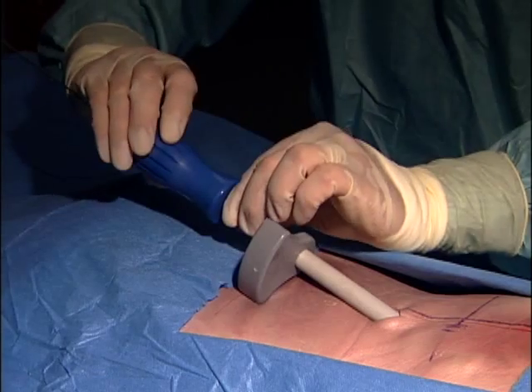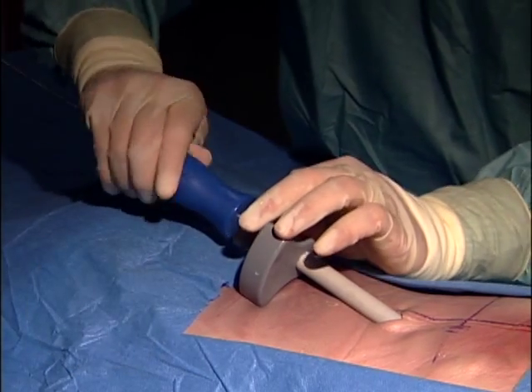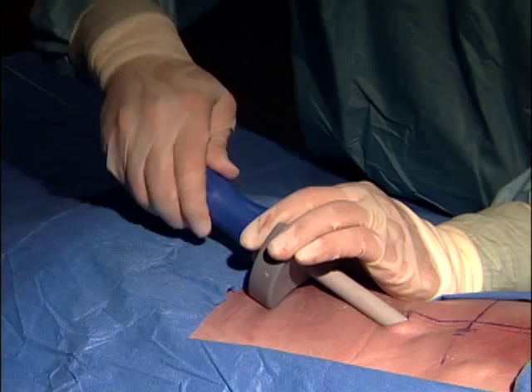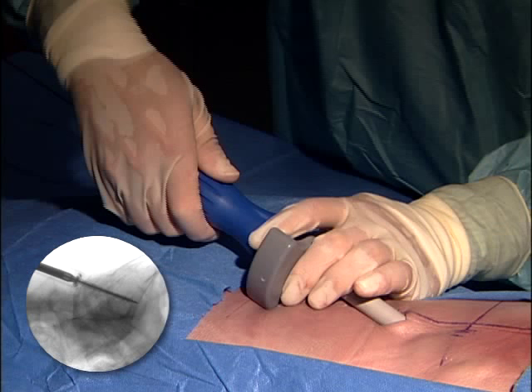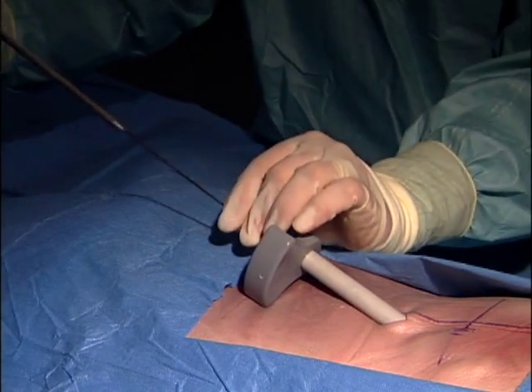The placement of the implant should be with a continuous forward clockwise motion, using a series of fluoroscopy images to ensure proper depth. Do not pull back on the driver when inserting the implant. This may disengage the implant from the driver, which could cause the premature advancement of the compression collar of the implant. The 4.5 mm bone lock PLS implant is inserted until the distal tip is at the desired location, leaving the proximal head of the implant slightly proud to allow for compression. After the proper position of the distal tip has been established, the driver is removed by pulling straight back.